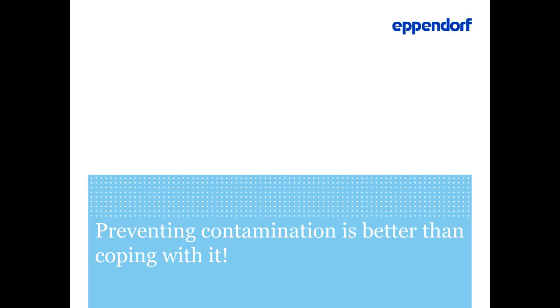Okay. So a lot of people were interested in the mycoplasma testing. So what is the best way to do it? How often should I do it? And does freezing of my samples actually affect the mycoplasma detection? Okay, so maybe first an answer to the last part of the question. The freezing should not affect the mycoplasma test.